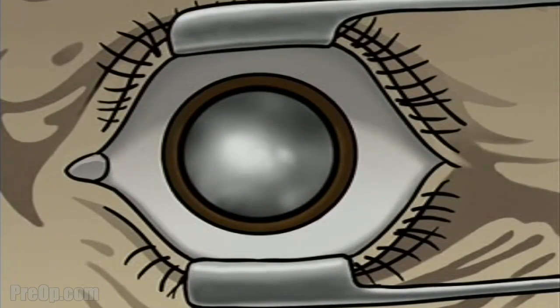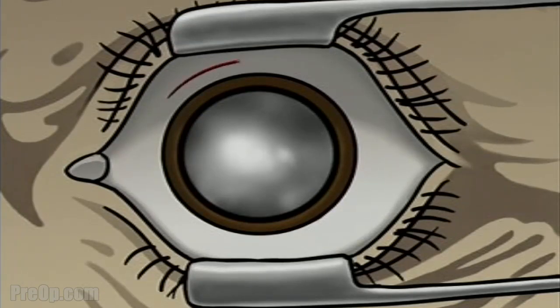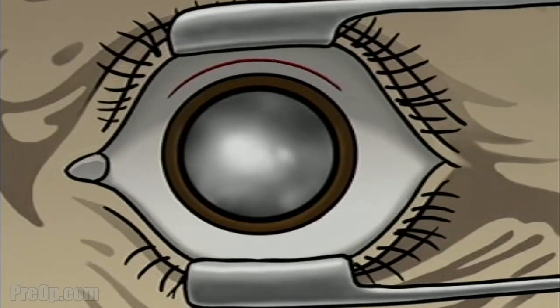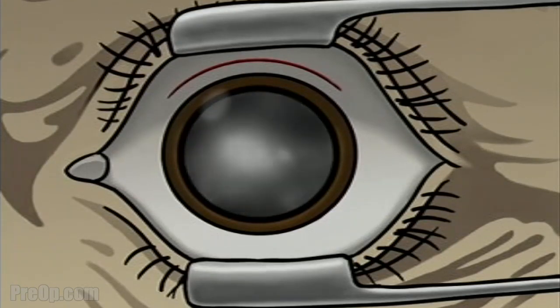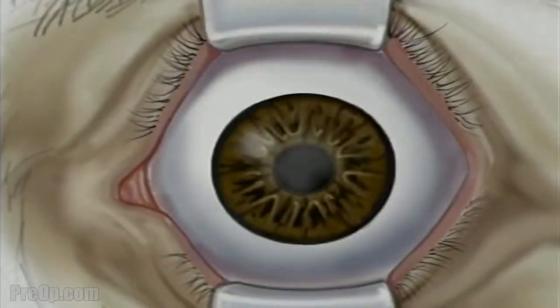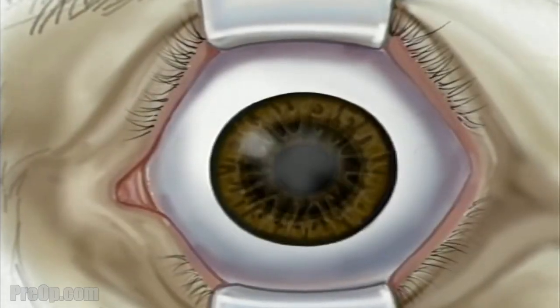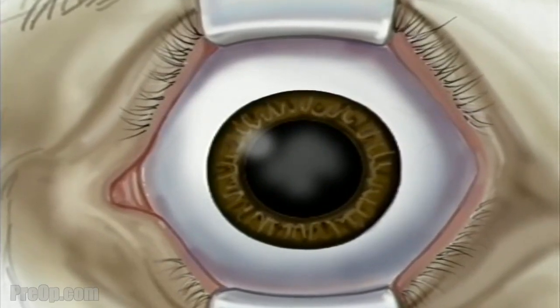Generally, replacing a cataract with an artificial lens is a simple procedure. It usually involves a single incision in the white of the eye. Through this single opening, the cataract is removed and the artificial lens is inserted.